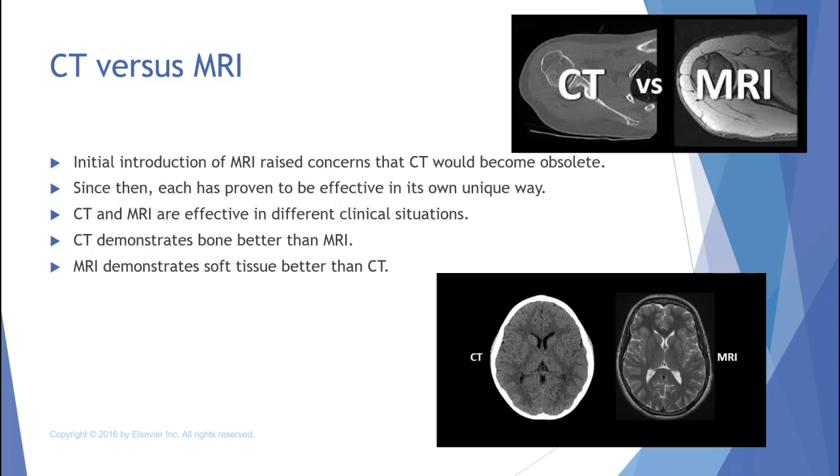It gives beautiful images of bone and soft tissue, although MRI is better for certain soft tissue. However, for vascular imaging in particular, CT gives gorgeous pictures. There is radiation involved though, so you have to weigh these things. Okay, CT does demonstrate bone better than MRI. So it's still utilized for fractures, etc.